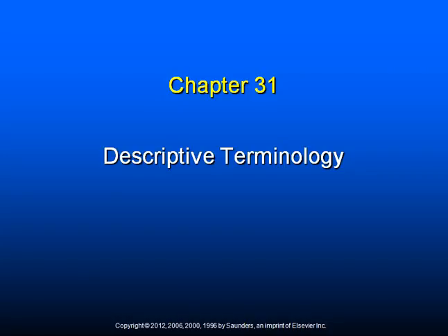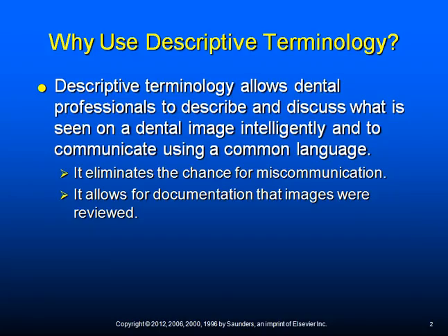Hello students, this is the lecture on radiography descriptive terminology. Descriptive terminology is the terms used to describe the appearance, location, and size of a lesion. This information should be documented for all lesions viewed on dental images.